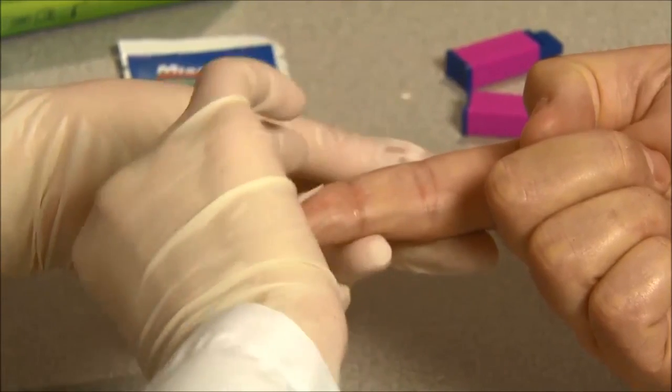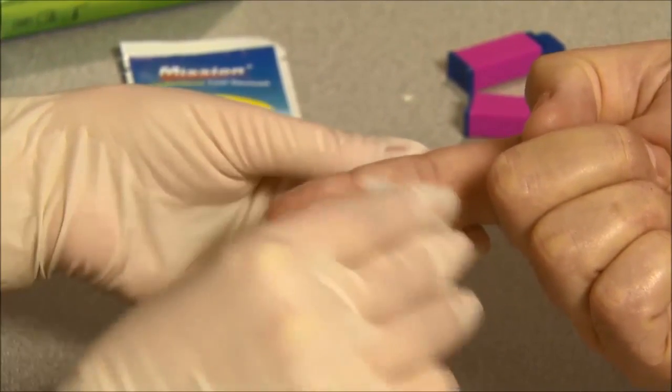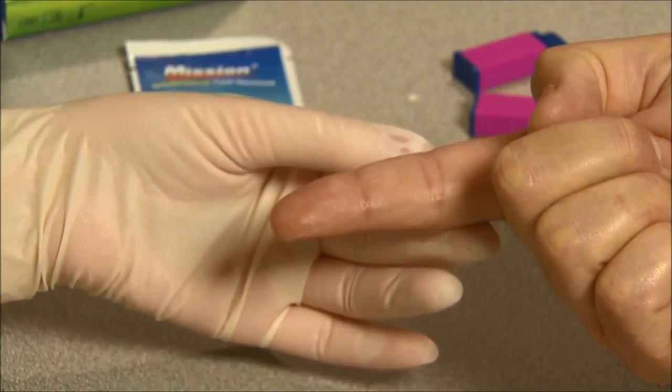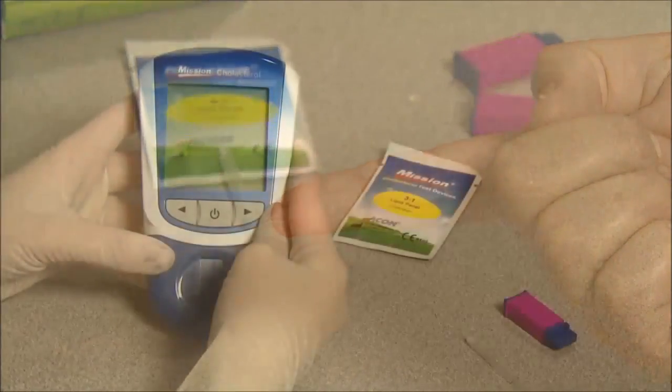Clean the testing site by washing your hands with warm soapy water and then dry them thoroughly. You could also choose to use an alcohol swab instead to clean the testing site and then let it air dry completely before testing.